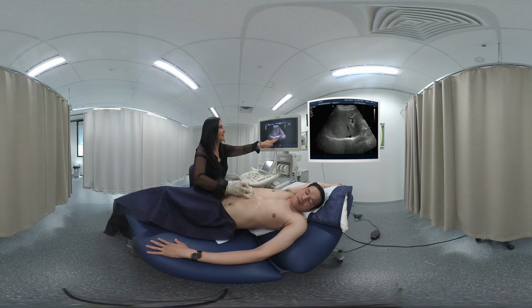We know that's not the gallbladder, but here we can see the gallbladder, and in a transverse plane, this is a dead giveaway. Can you see that there? It's quite obvious. However, it's not painful. Now, in this patient, breathe away, patient. Now, what we can do as sonographers to test for this, so this looks like quite a chronically inflamed gallbladder, we can do a test called the positive Murphy's test.